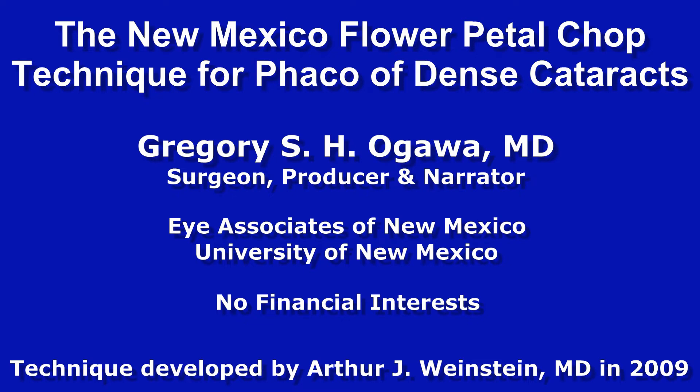The New Mexico Flower Petal Chop Technique for FACO of Dense Cataracts by Gregory Ogawa. No financial interests. This particular technique was developed in 2009 by Dr. Arthur J. Weinstein at Eye Associates of New Mexico.